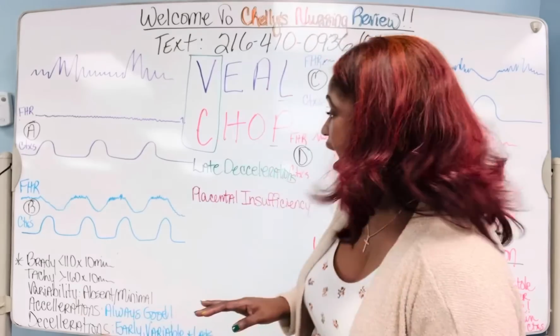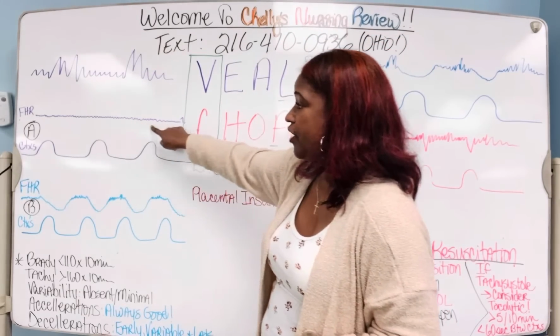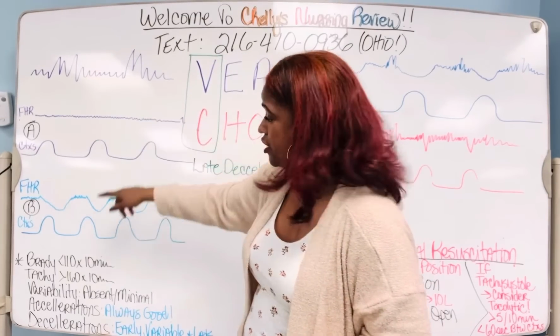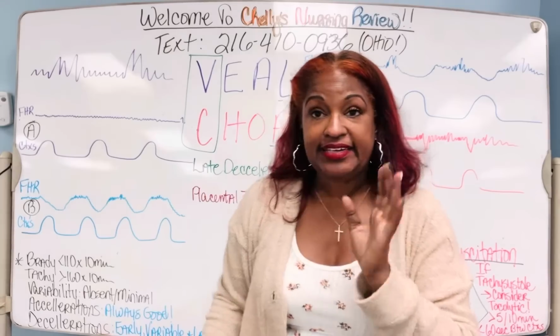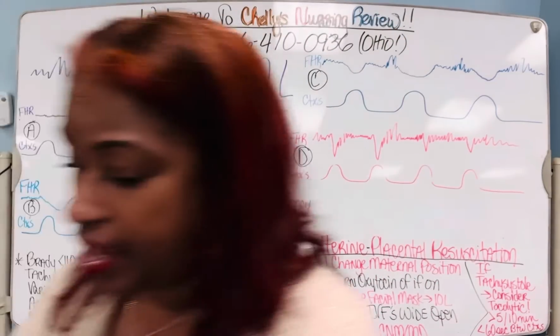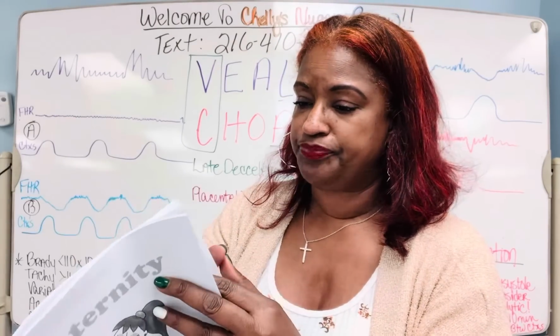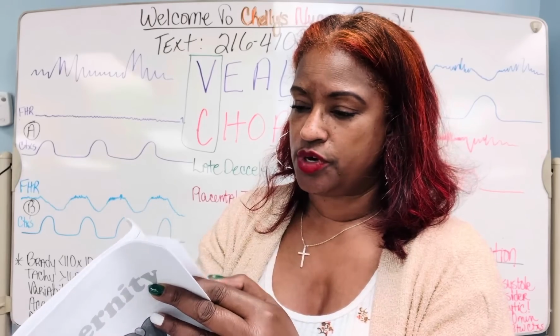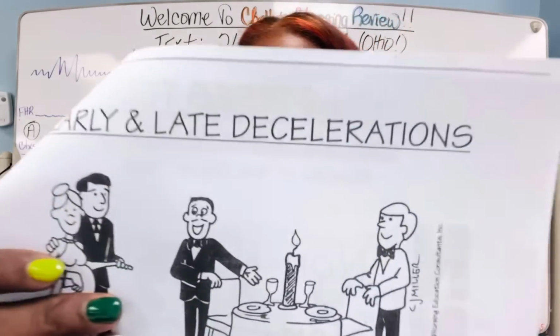When a patient has late decels, there typically is minimal variability in between. So if you look, you can kind of tell what I mean. But the way late decels act, and I do want to show you the page in the maternity handout so that you don't forget, because it's kind of like an easy way to remember it. I just want to show you this real quick, if you've been following along in your handouts that you get when you do the self-study.